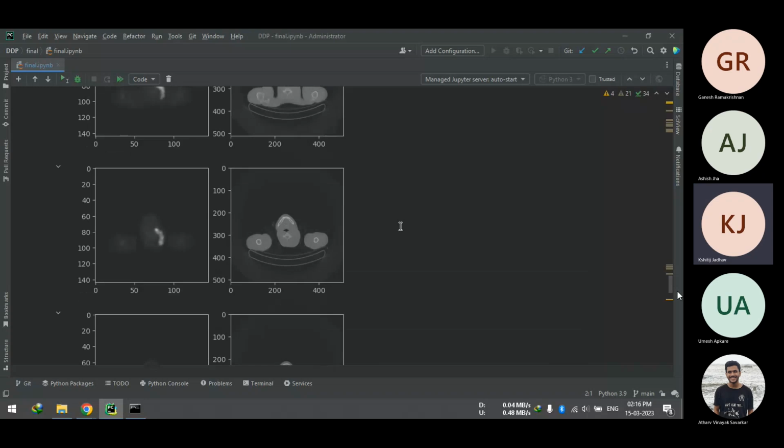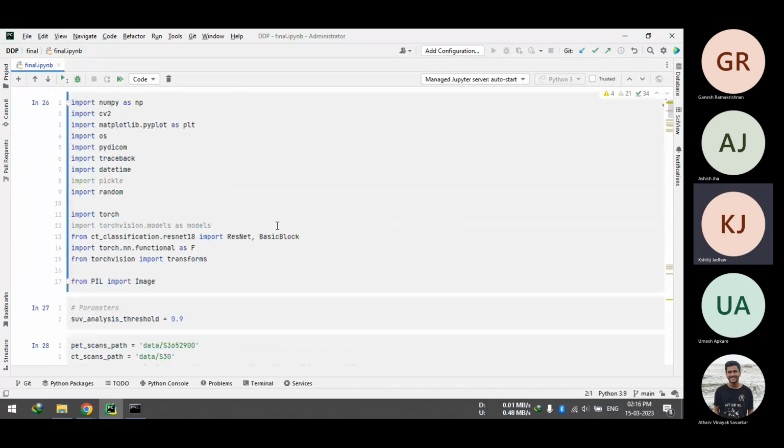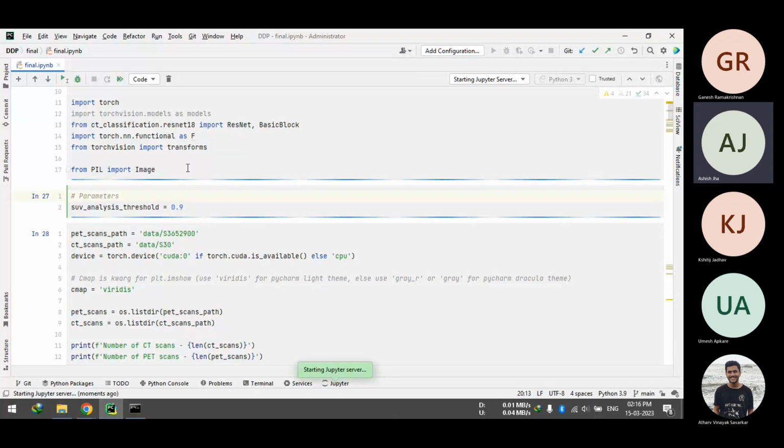Ashish, the question in more detail is this: currently the segments that we're dividing the CT scan images into are just 4: head and neck, thorax, chest and abdomen, and legs. I think we should add pelvis in this.